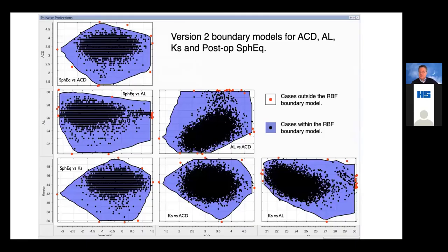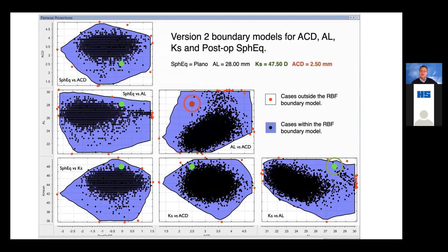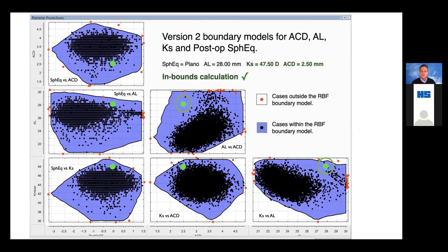Version two was based on about 12,400 cases, and now we've expanded our boundary models, which means improved inbounds calculations. Taking a longer eye of 28 millimeters with a very steep cornea — the patient we looked at just a minute ago — you can see that now it's an inbounds calculation. The shallow anterior chamber depth also becomes an inbounds calculation because we now have enough data to support it at a 90% half-diopter accuracy level. As we increase both the amount and quality of data, the inbounds calculations increase as well.